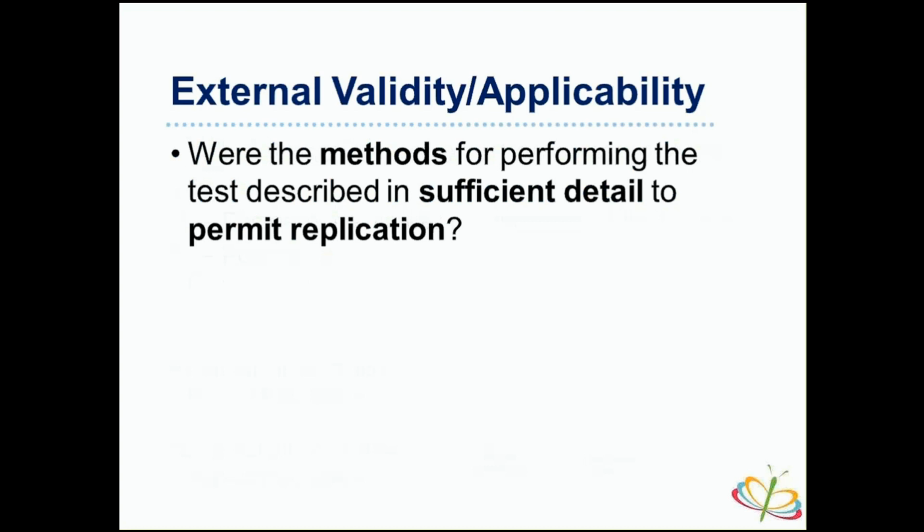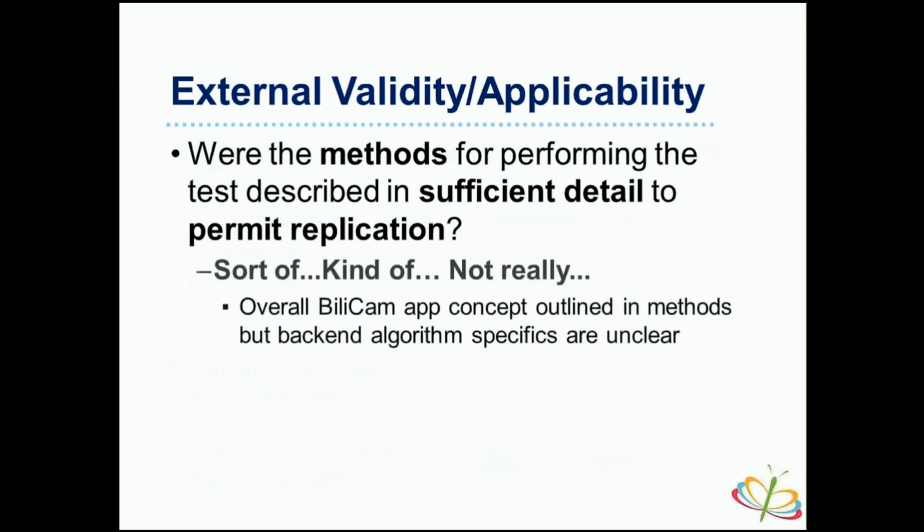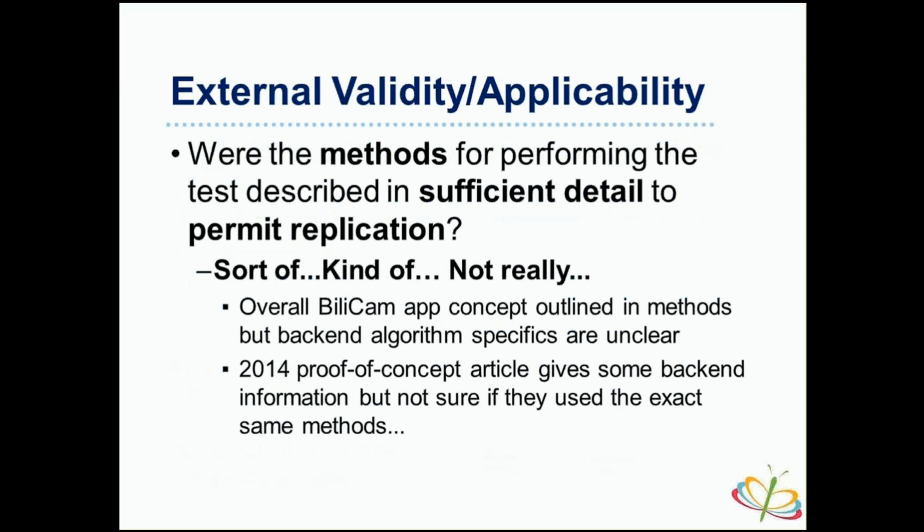All right, and then the last question here is, were these methods described in sufficient detail to permit replication? Nah. To be fair, there's a lot of back-end stuff. There's a lot of very computer science-y algorithm back-end where even if you had gone through all of it, it would have been a dissertation and a lot of algorithms that we honestly would not really have appreciated. They have submitted this app and the whole background process for a patent, which is still under review. So you are able to get some of the information if you're kind of sneaky and start Googling a lot, which obviously I did.